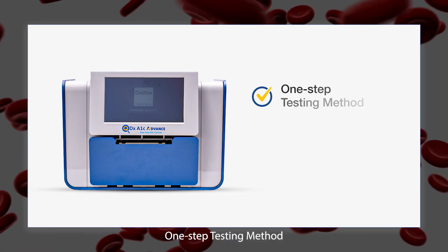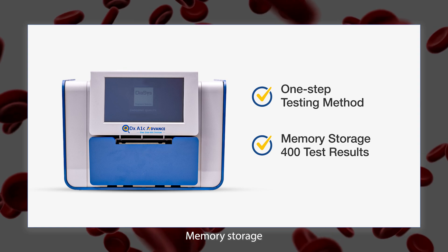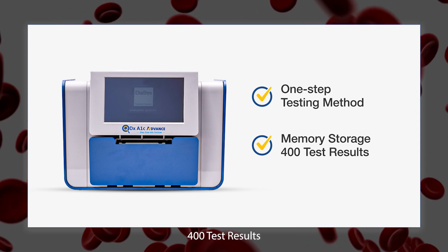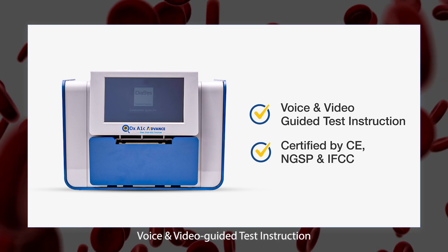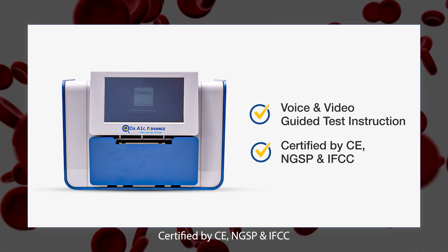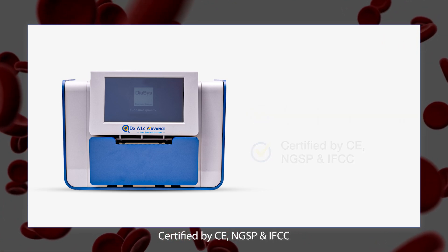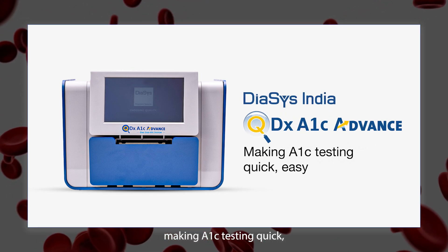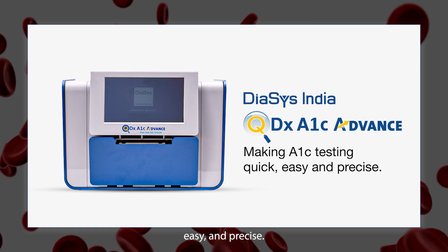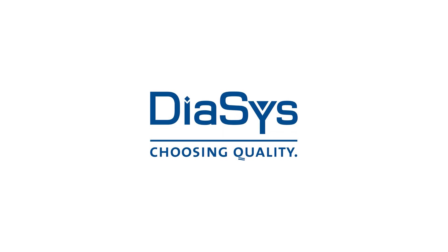1-step testing method. Memory storage for 400 test results. Voice and video guided test instructions. Certified by CE, NGSP and IFCC. DICE's QDX A1C Advance — making A1C testing quick, easy and precise.